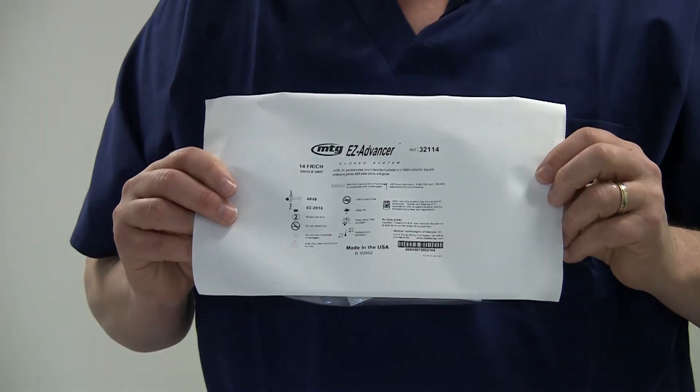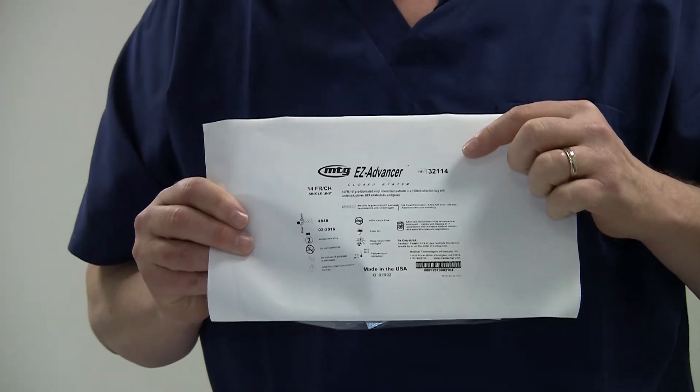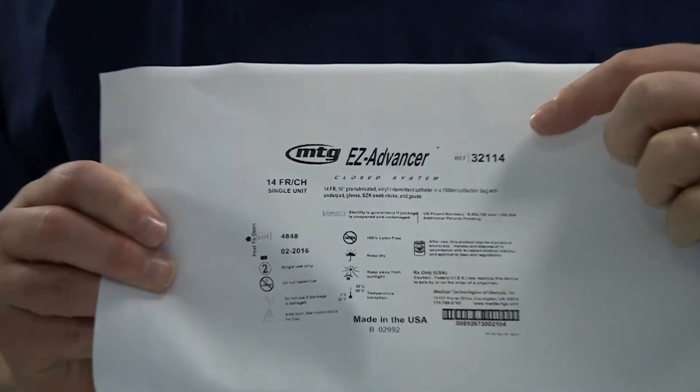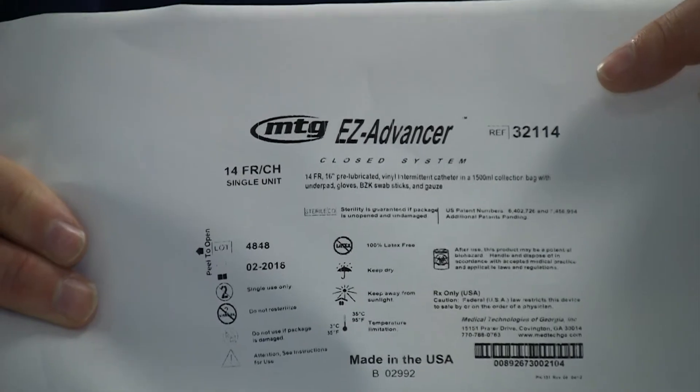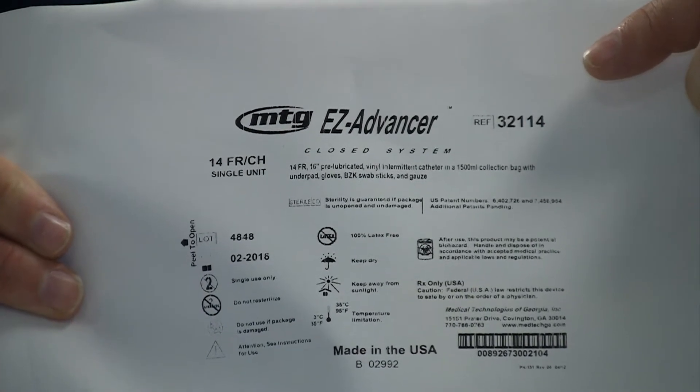Now let's have a look at EasyAdvancer. Keep in mind the last two numbers in the reference number are the French size. In this case, 1-4 would denote a 14 French catheter.